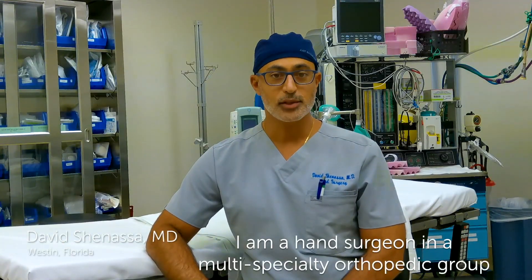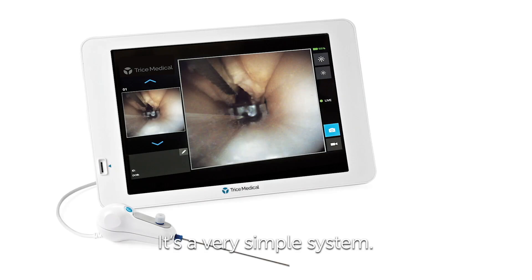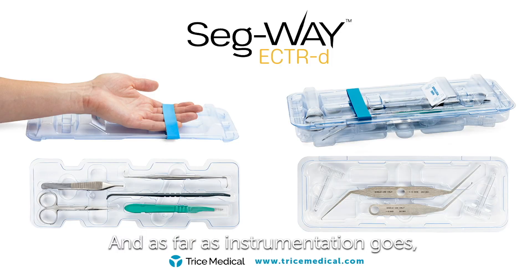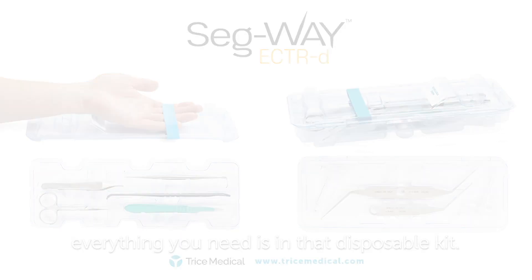I'm David Shenassa. I'm a hand surgeon in a multi-specialty orthopedic group in Weston, Florida. It's a very simple system. One tablet, one wire. You put it on a Mayo stand. And as far as instrumentation goes, everything you need is in that disposable kit.